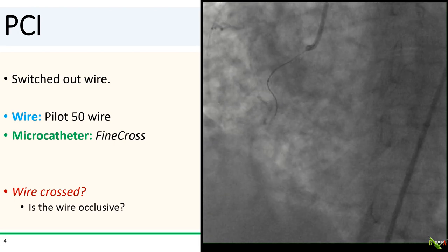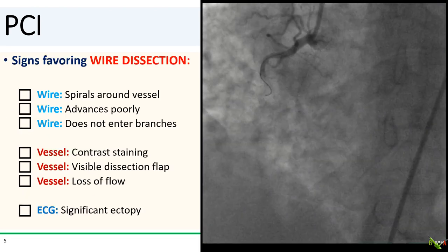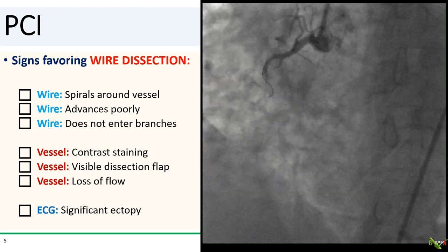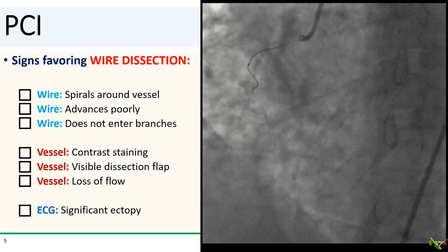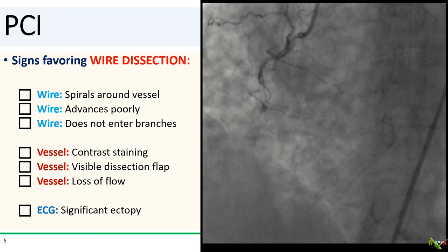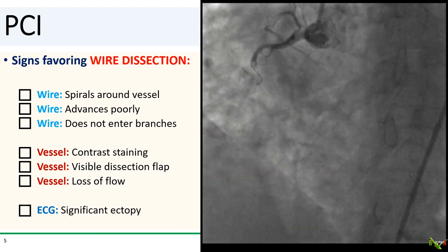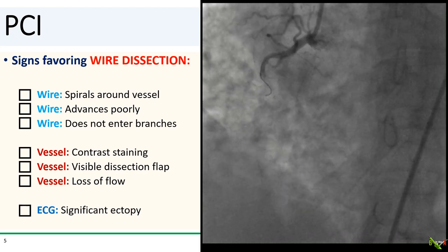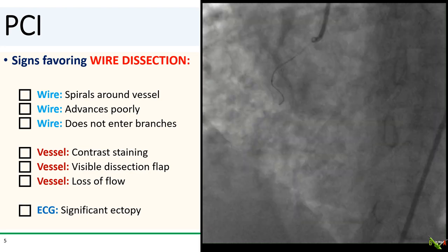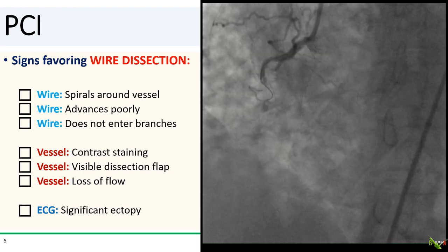Maybe the lesion is just so tight that the wire is now occlusive. So are we just occlusive, or are we actually now dealing with a wire dissection? There are some signs that favor a wire dissection. You're probably dealing with a dissection if your wire seems to be spiraling around the vessel, if it advances poorly, or if it does not enter any of the side branches. You're also probably dealing with a dissection if the vessel shows contrast staining, or if you actually see a dissection flap.